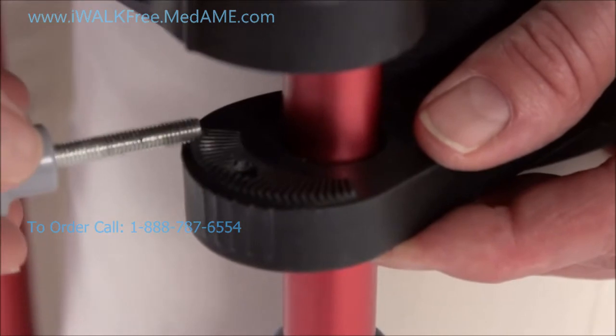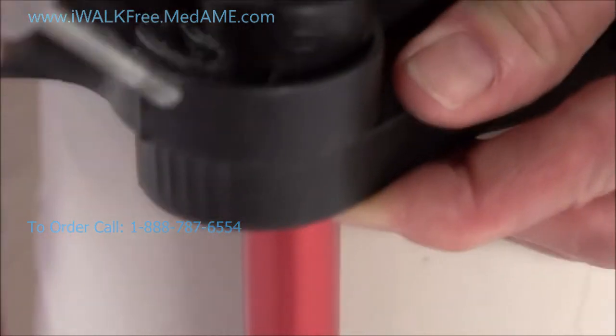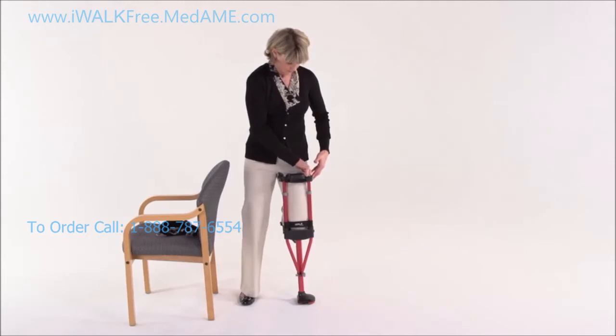There are interlocking teeth on the bottom of the handle and the top of the thigh support. They'll keep the support from slipping after you've tightened down the thumb screws. Now do the same thing for the outer thigh support.